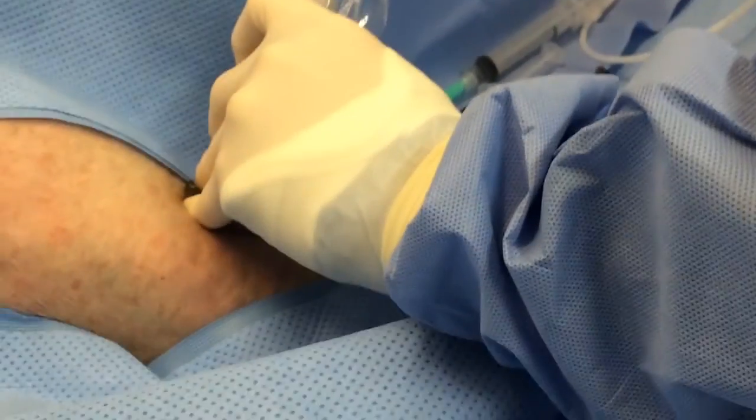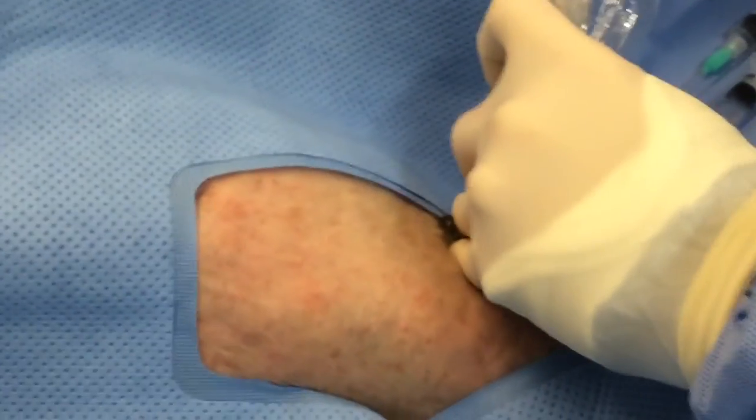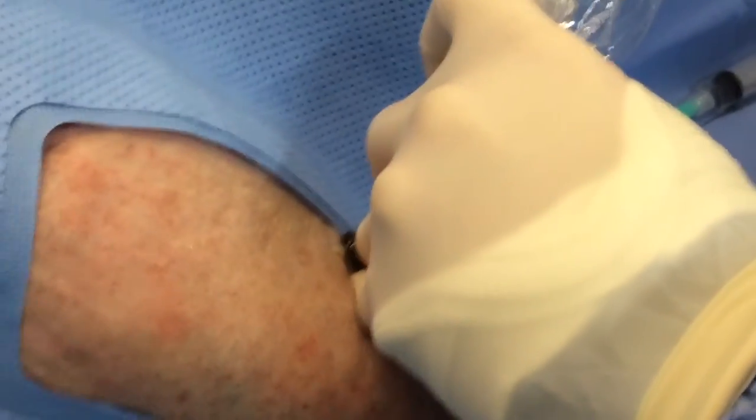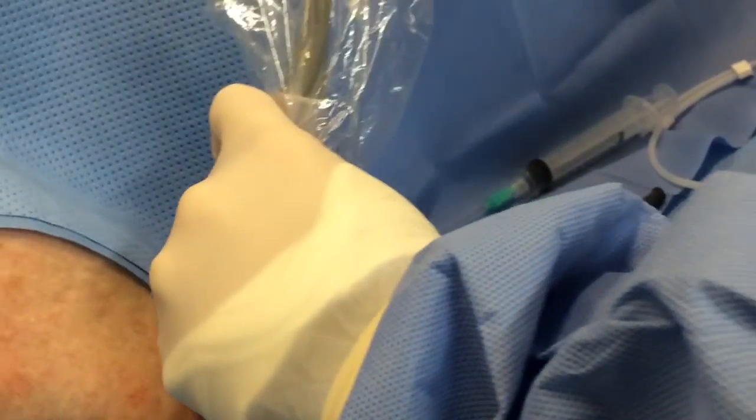So I figured what I'd do is show you the actual procedure first and then talk about it a little bit. So here's Rory with an ultrasound identifying a vein. He sees a nice big plump vein.